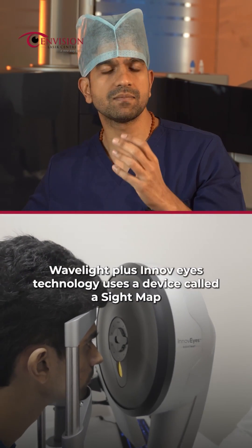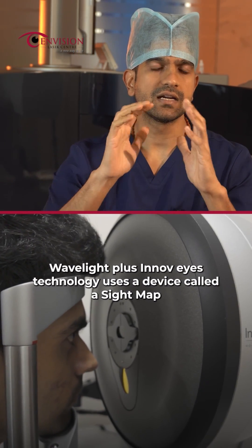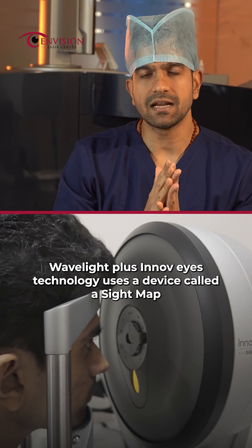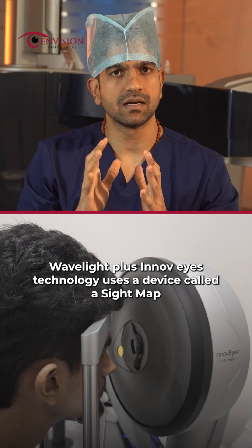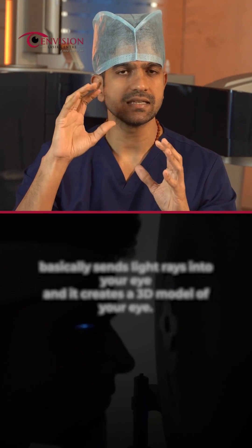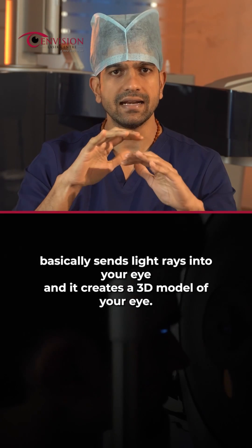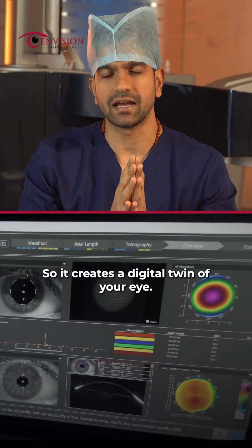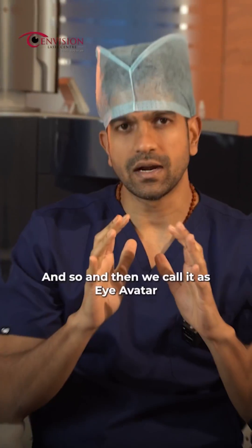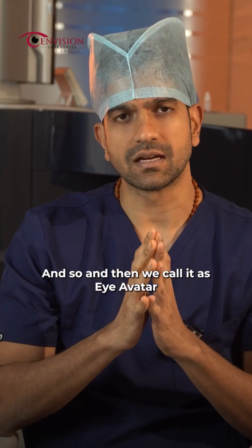Wavelight Plus uses a device called Sight Map. This device basically sends light rays into your eye and creates a 3D model of your eye — a digital twin of your eye. We call it an eye avatar.